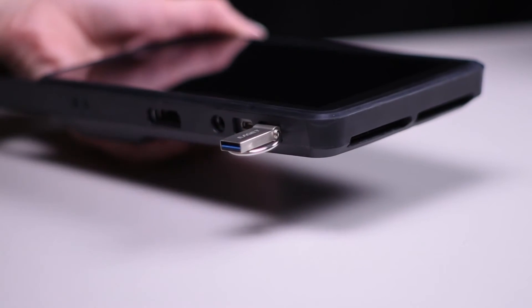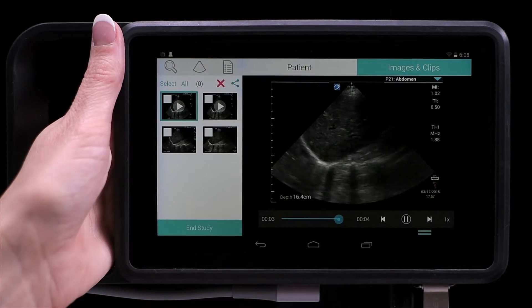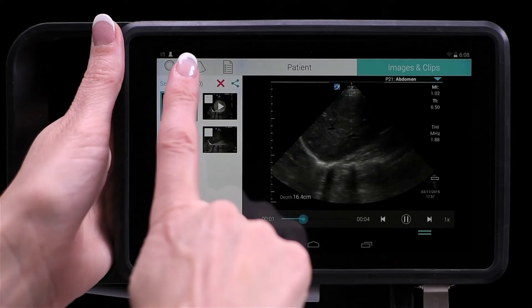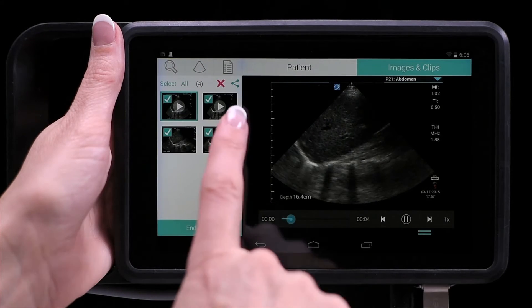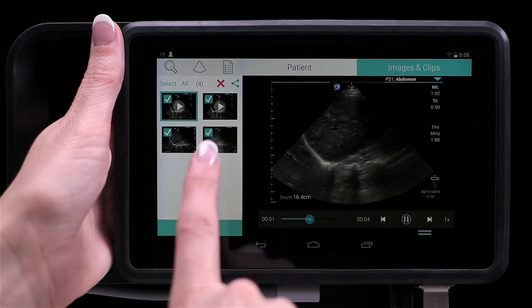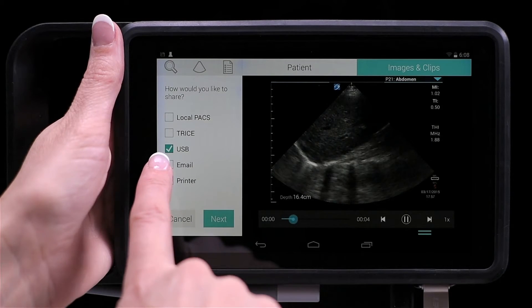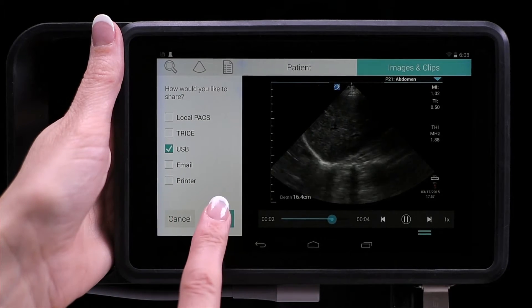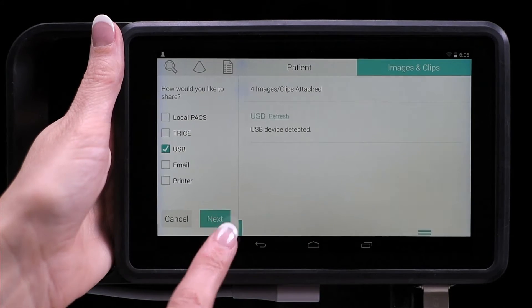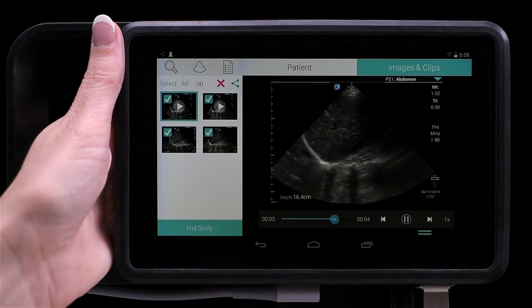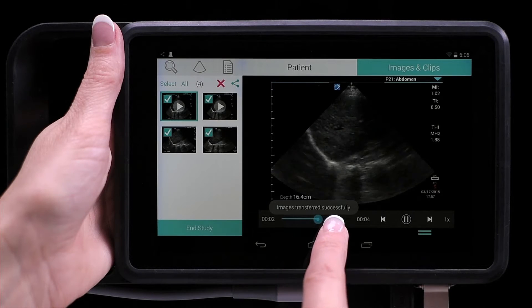To export to USB, tap Select. Tap the images and clips you want and tap the share icon. Select USB, tap Next, and then Share. You'll see the export status on the screen.